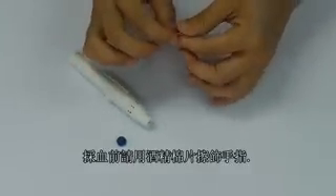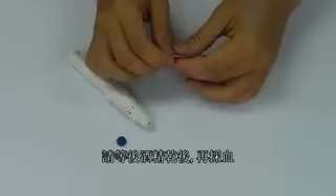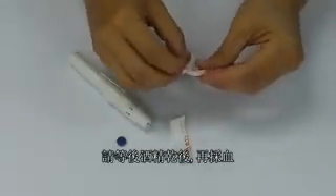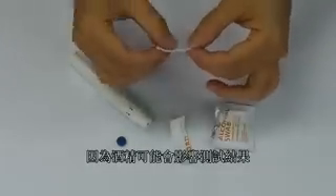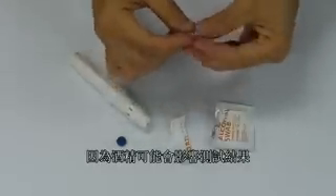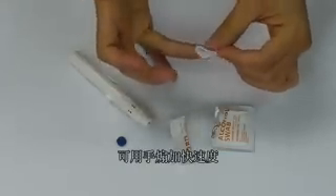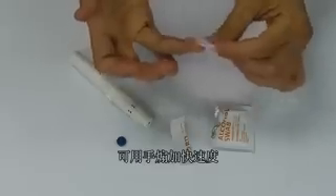Sterilize your finger with an alcohol swab. Be sure that the lancing site is completely dry before testing, as any remaining alcohol may influence the test. Fan dry the lancing site to speed up the drying process.